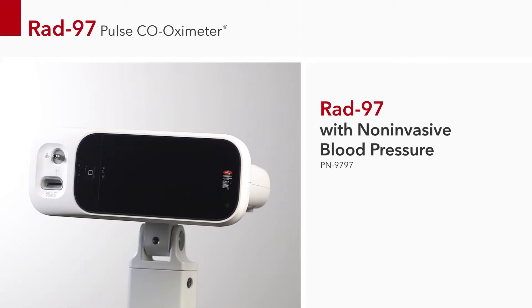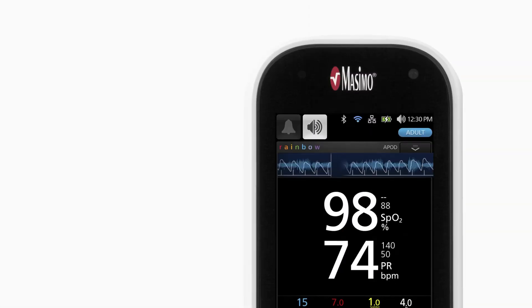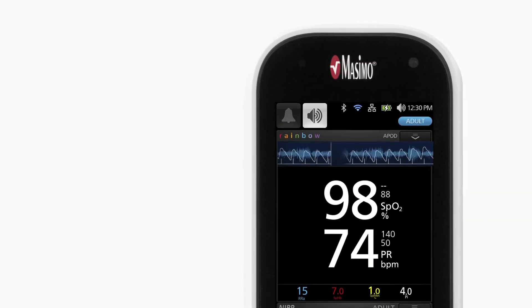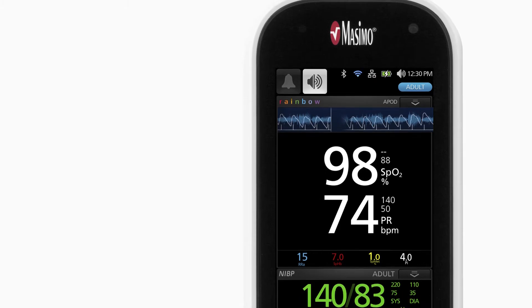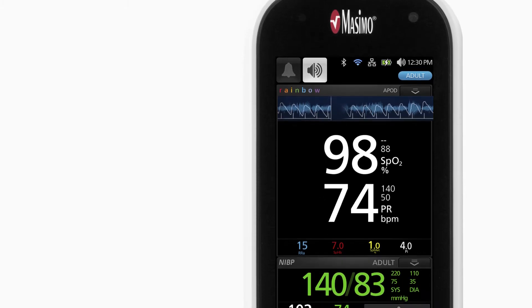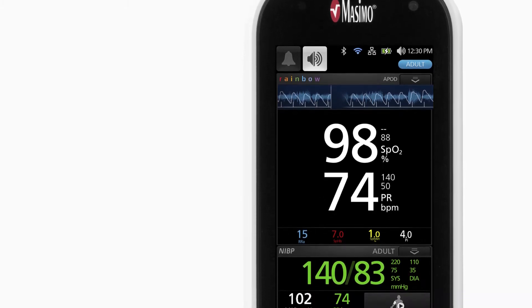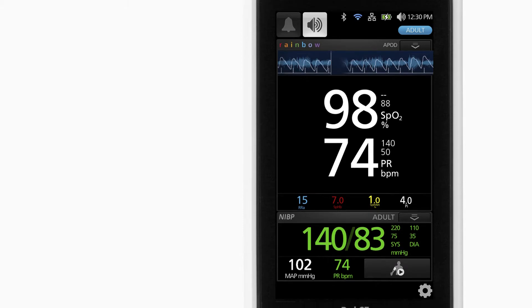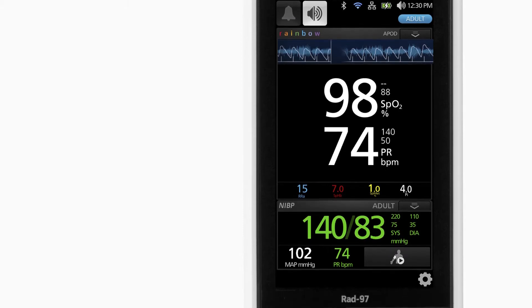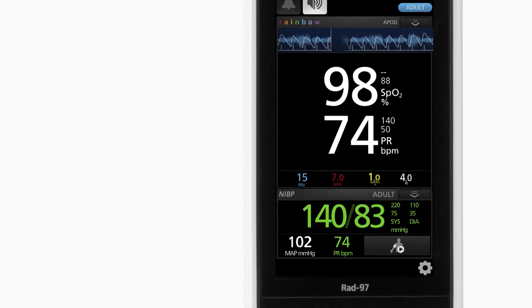The RAD 97 pulse co-oximeter is available with integrated non-invasive blood pressure, featuring an oscillometric method of measurement with a direct connection for a blood pressure hose. Non-invasive blood pressure readings can be taken for adult, pediatric, infant, and neonatal patients.